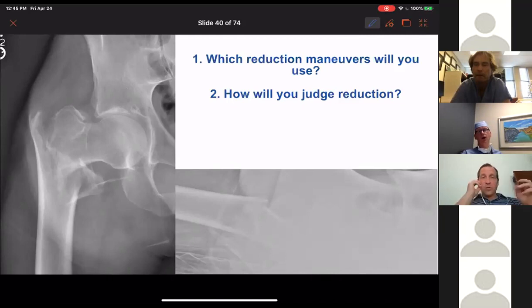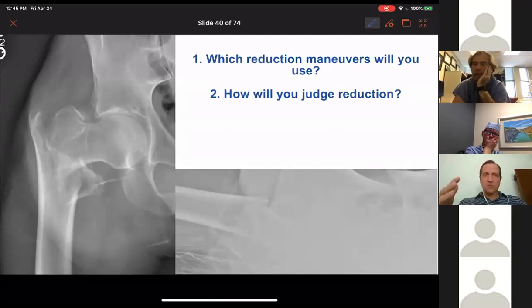Honestly, when I'll make a small perc incision, I'll extend it more just so I can palpate the fracture line, just because I'm so curious based on what the leg looks like, what the fluoro looks like, and what the actual rotation is. Unfortunately, on a fracture table with traction, it seems like that's often locked in, it's tight in there. Tom, go ahead. Go ahead, Paul. The only thing I was going to say is I like what Mike's saying there and what everybody's saying, because it is hard. I find myself, if I'm maximally internally rotated, that's the only way it looks good. I'm clearly fooling myself. So I do like to open up a little bit and kind of feel in there.